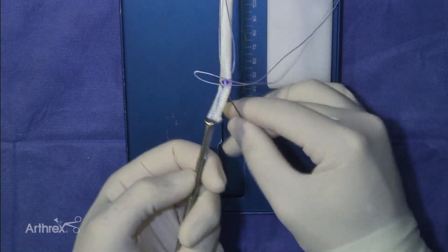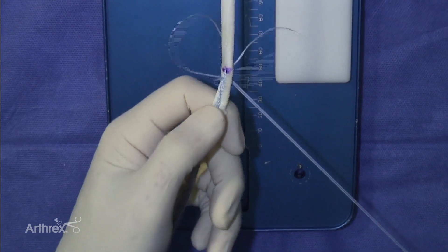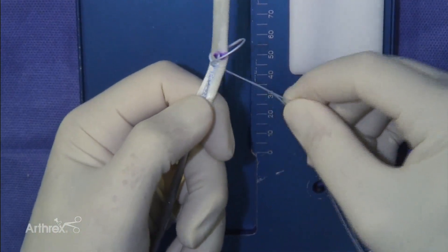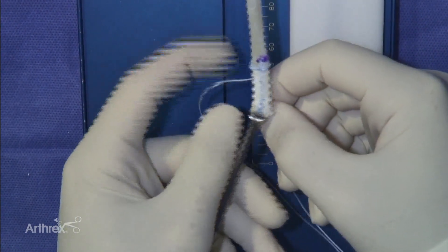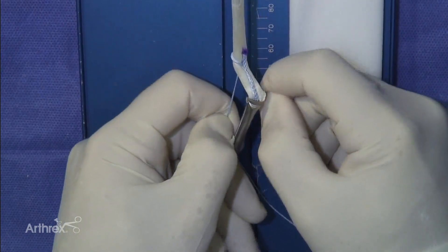Pass the needle through the fiber tag and graft just distal to the mark on the graft. Pull the suture through the graft to create the first set of stitches. Pull each fiber loop suture strand firmly to tension the stitch.